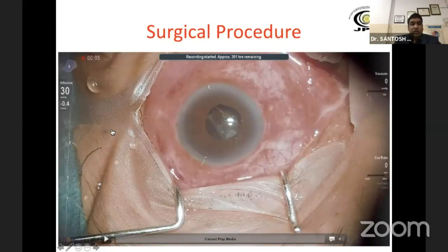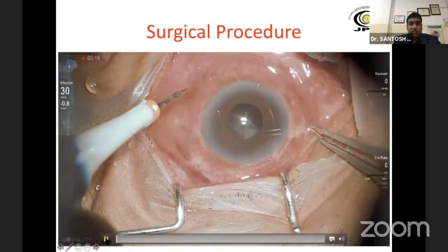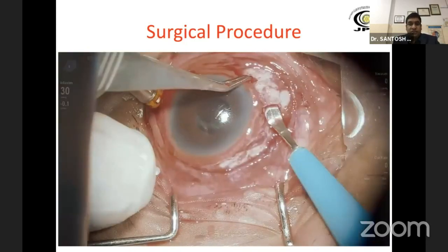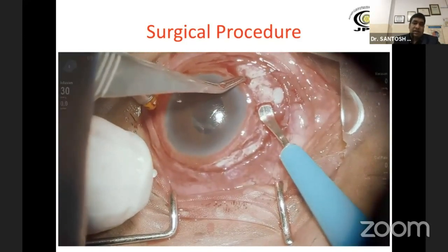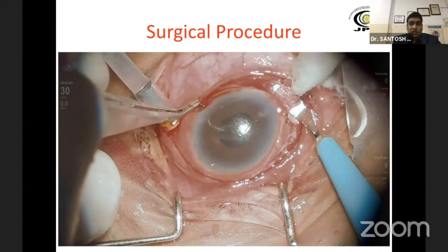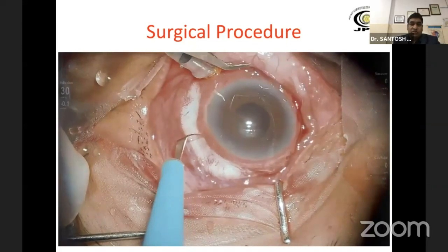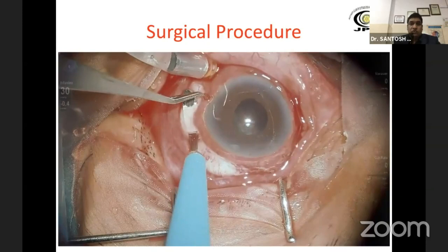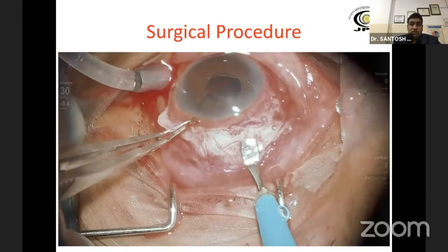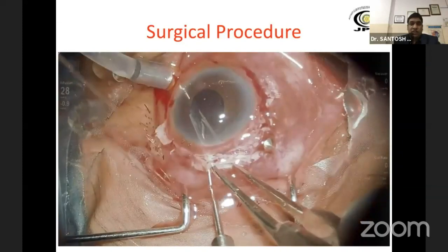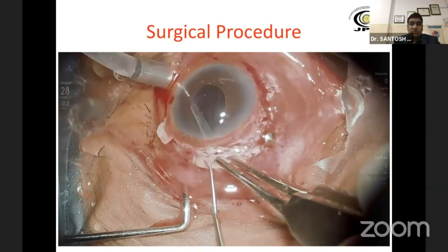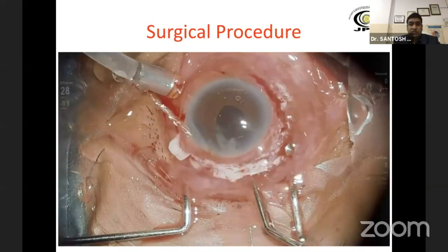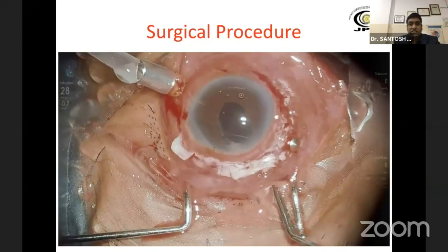This is another example where a rigid IOL had not fully dislocated but was subluxated, with a lot of vitreous and capsular bag material and cortical material around it. I always place an infusion cannula which makes the globe rigid and also facilitates vitrectomy to clear all the vitreous. The same way flaps are made and tunnel made, and now trying to grasp the IOL — because it is entangled with capsular material and some vitreous, it was taking a little time. Now it has come out. You can see this is a rigid IOL.